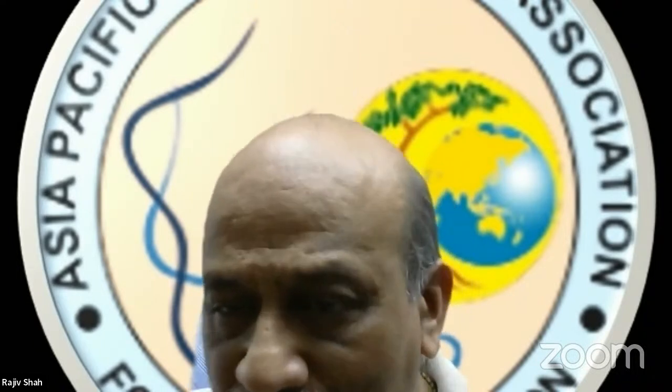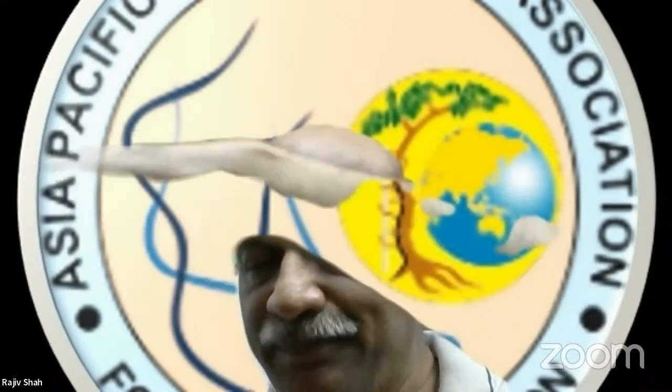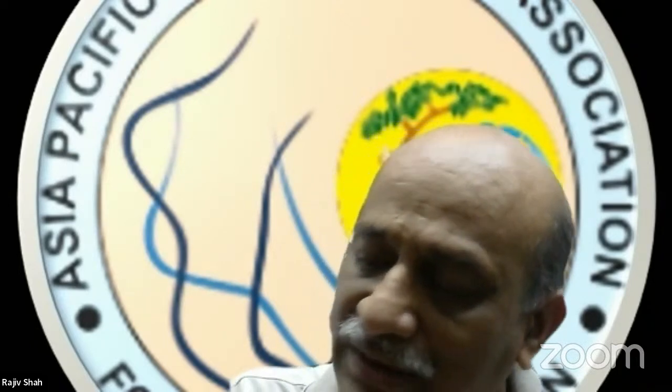There is a question: tips on putting a screw into the navicular bone, as it is a convex bone, very difficult to align. You are absolutely right. It is a convex bone in both planes. In one plane, it is going from medial posterior to lateral dorsal. And in another plane, it is matching the head of the talus. So yes, it is definitely difficult, but you should frequently use internal oblique as well as external oblique views. That is very important. Second thing, you should be able to judge which is the bigger fragment and where it is lying. Is it dorsolateral? Is it dorsomedial?